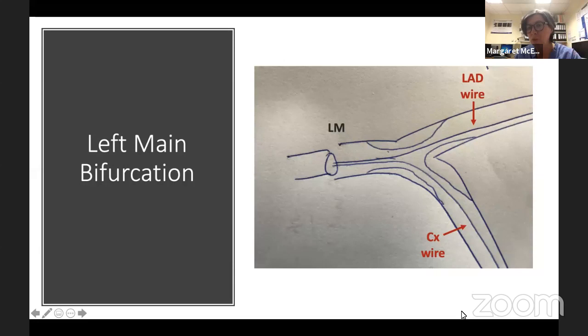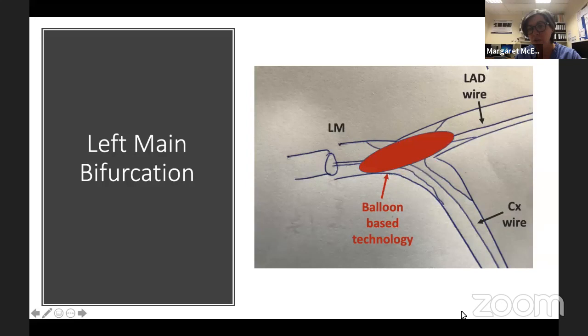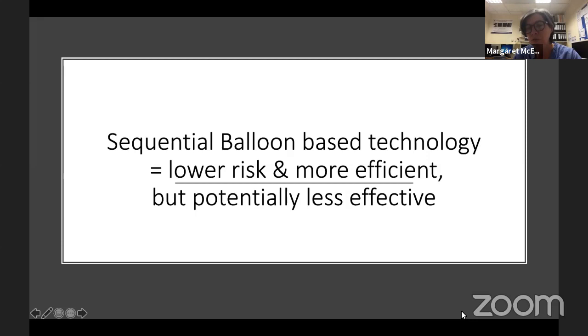Alternatively, if you're able to maintain wires in both limbs — a wire in the circumflex, a wire in the LAD, and even if you had a trifurcation, a third limb — and you have an effective balloon-based technology, you use that on the first limb, then the second limb, and then go on and do your two-stent bifurcation technique. This is a much more efficient way to do it, with lower risk, avoiding the need to rewire repeatedly through disrupted plaque.